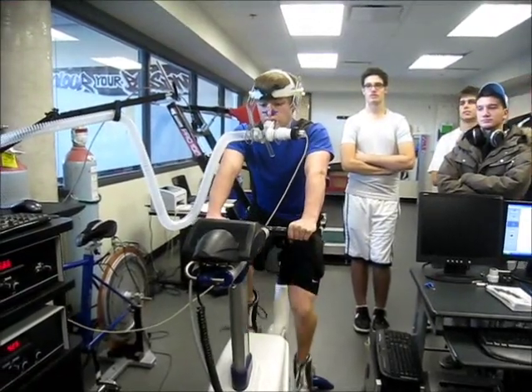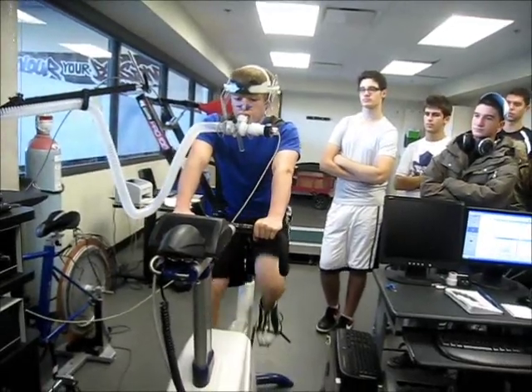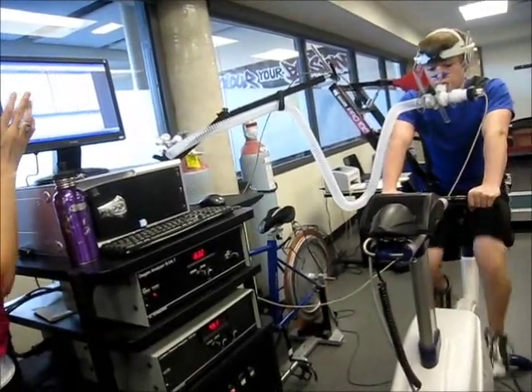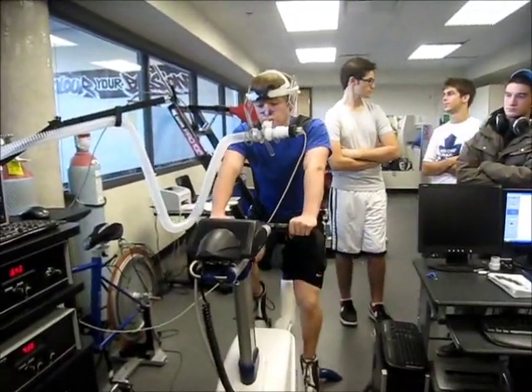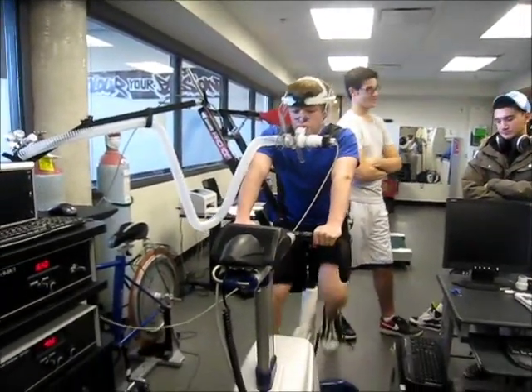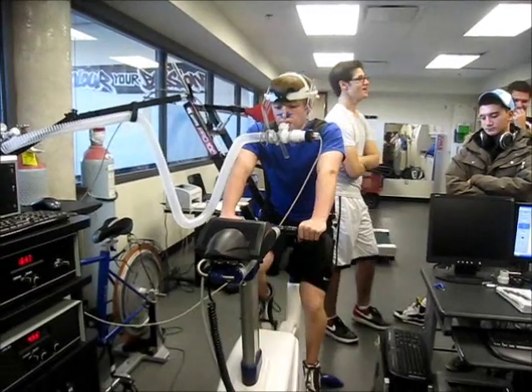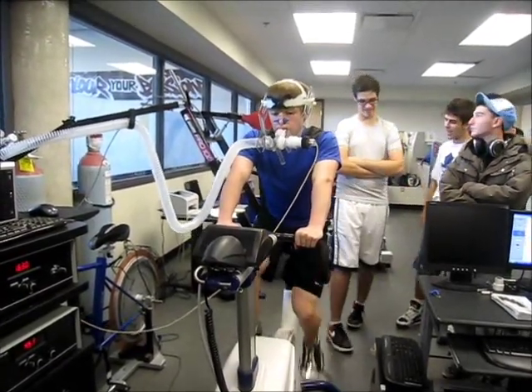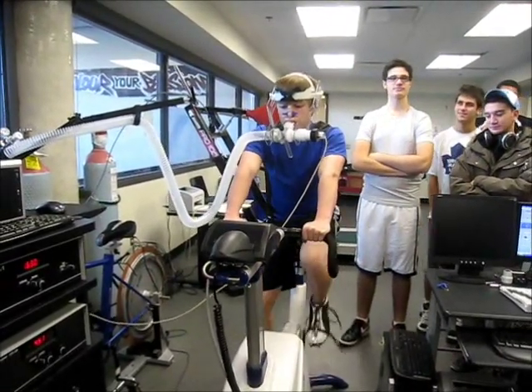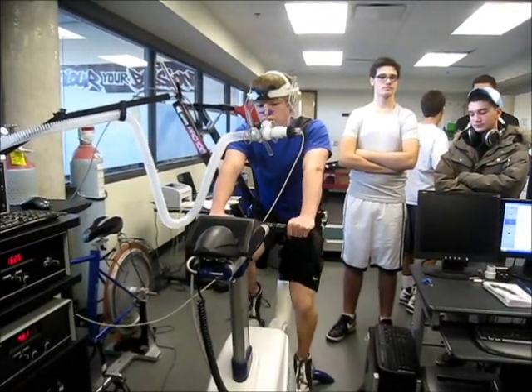If you guys want to look at these graphs — this one over here is VO2, the amount of oxygen he's taking in. This system is a metabolic cart that's able to analyze the oxygen to give us that value. When I said 50 was the score, we're going to see that throughout. That early reading was probably when he might have been a little nervous and breathing in more before the test started. Often before the test starts you're a little nervous, so your VO2 can be higher than what's typically resting. Then once you start exercising you can see a little dip, because you're getting used to it and you're not nervous anymore.